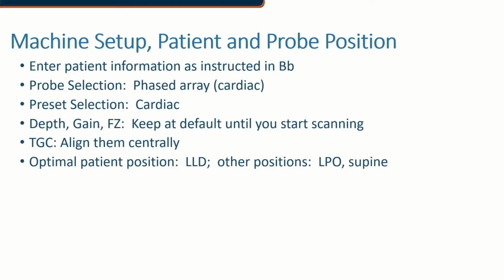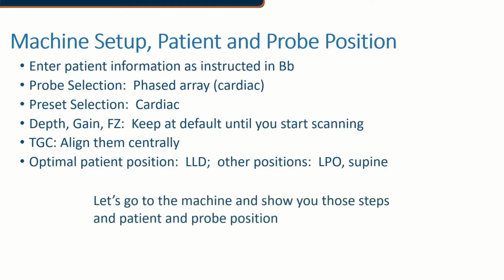And sometimes I will tell you that supine does work with a lot of folks, but you still may want to roll that patient up a little bit to get better views. Now let's go to the machine and I'll show you those steps on the patient and the probe real quick.